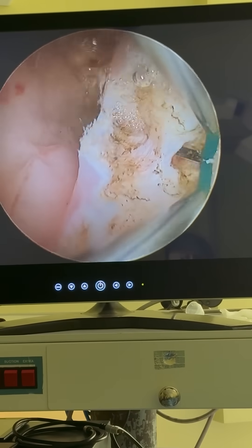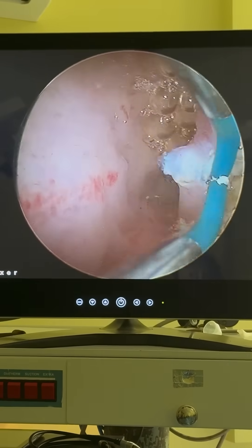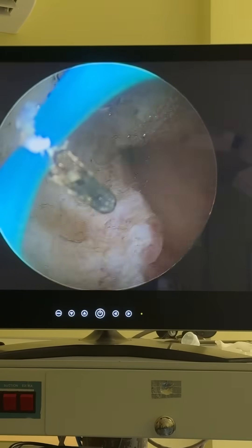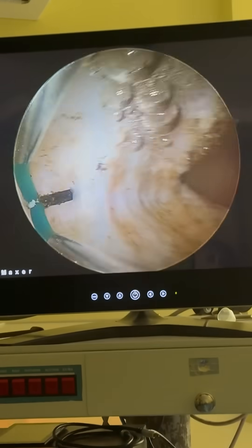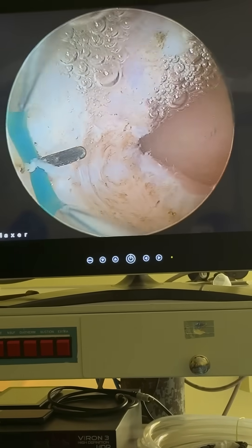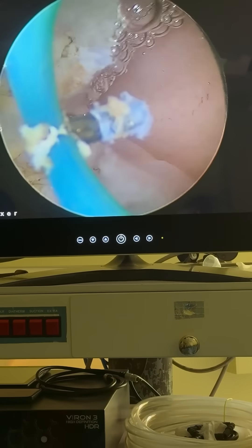Doing the procedure quickly is very important. Aligning the resectoscope properly with the septum is key because each case is unique — the septum could be either a broad one or a narrow one like this. An indentation in the fundus could also be a problem sometimes, and perforation is also a possibility.